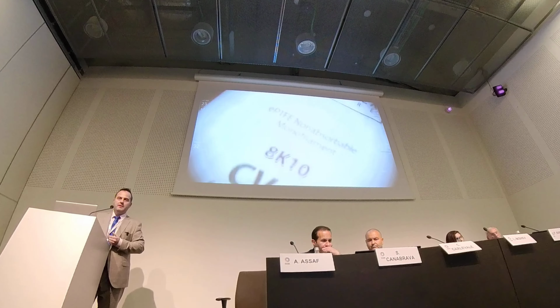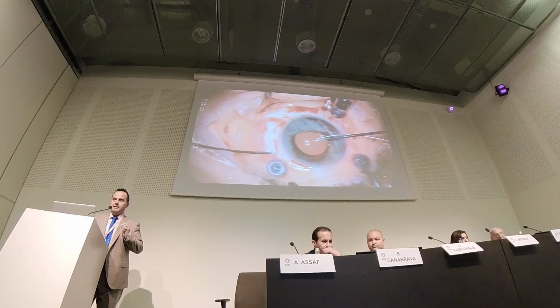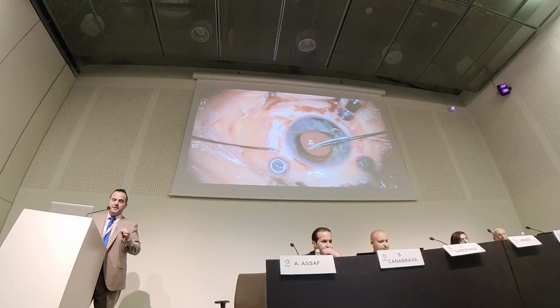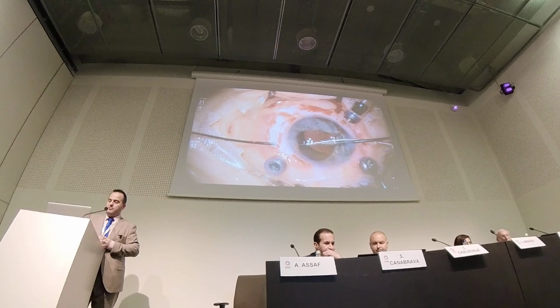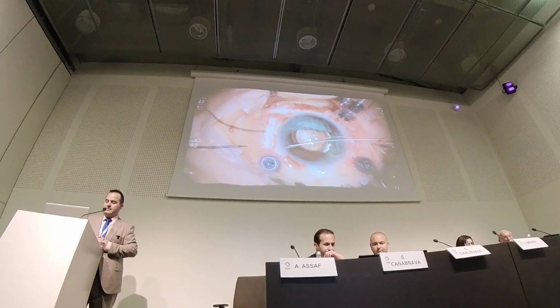It should be CV8. It is really difficult to be found, but it's 8.0 as a size, and it is thin enough to be used in ocular surgery. Again, the same handshake approach, and again the same horizontal scleral pockets.